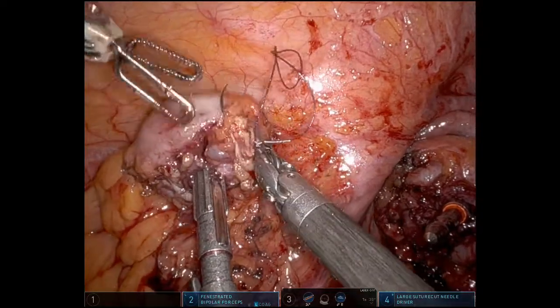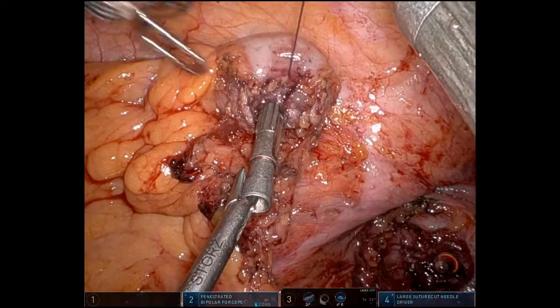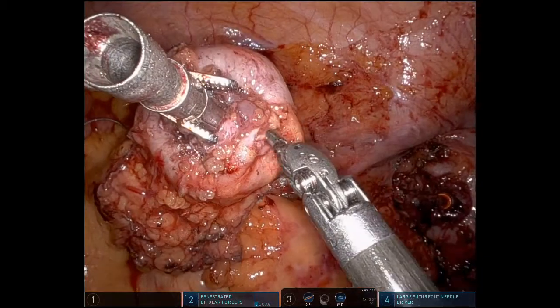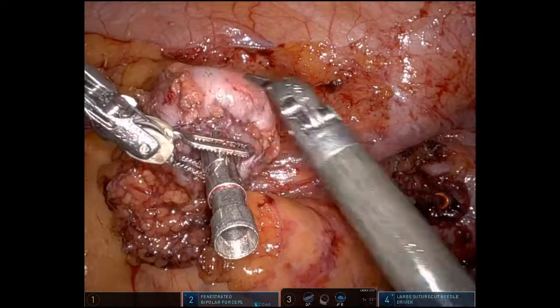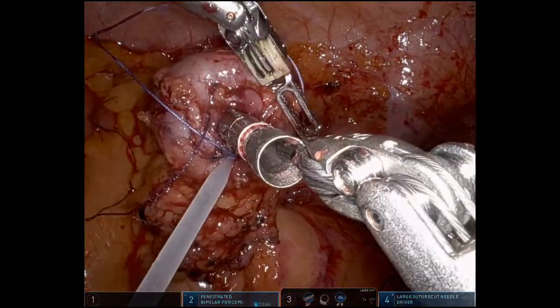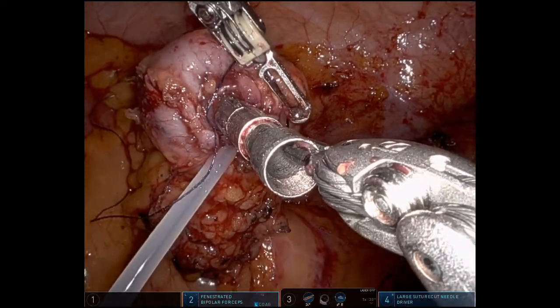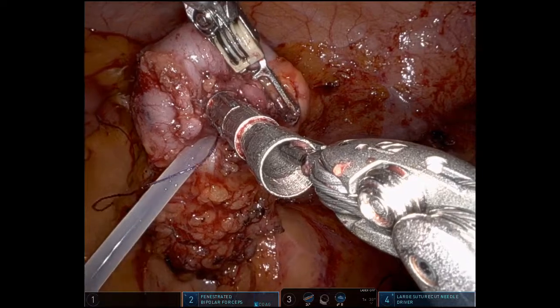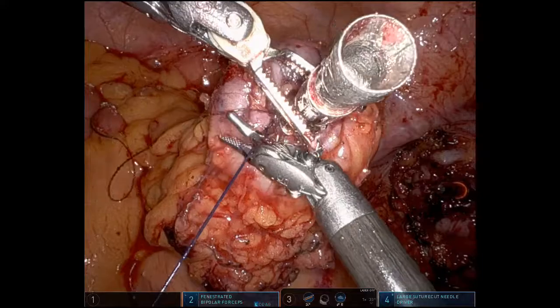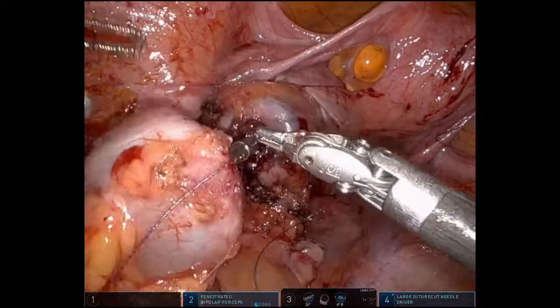I think this is well worth it. When you have tissue that's bunched up against the anvil and you do your anastomosis, you just don't know what's in there — and to me, that's where the failures come. Now observing this again, it looks really good where we put in the large diverticulum, but there's still some outward pouching. So we do another endo loop just to get it more secure, making sure everything is brought in very tight around the neck of the anvil. Our final examination — now that looks like a really good area on that anvil. We connect it to the rectum and we have our nice anastomosis.